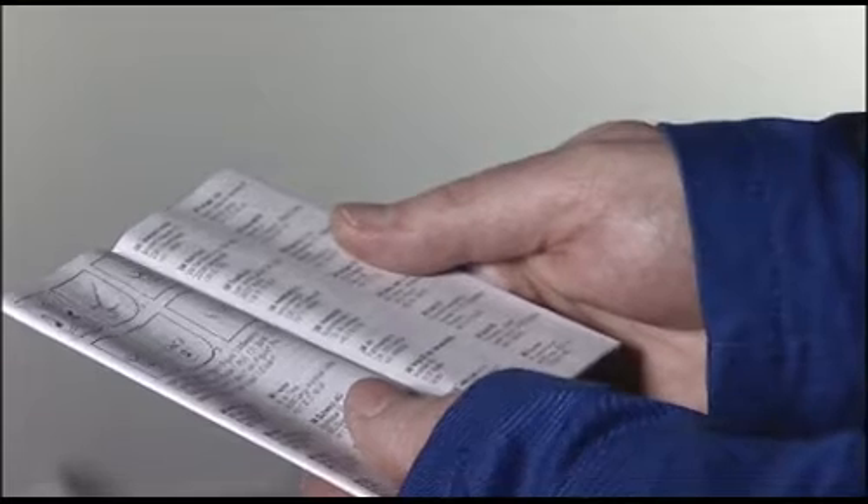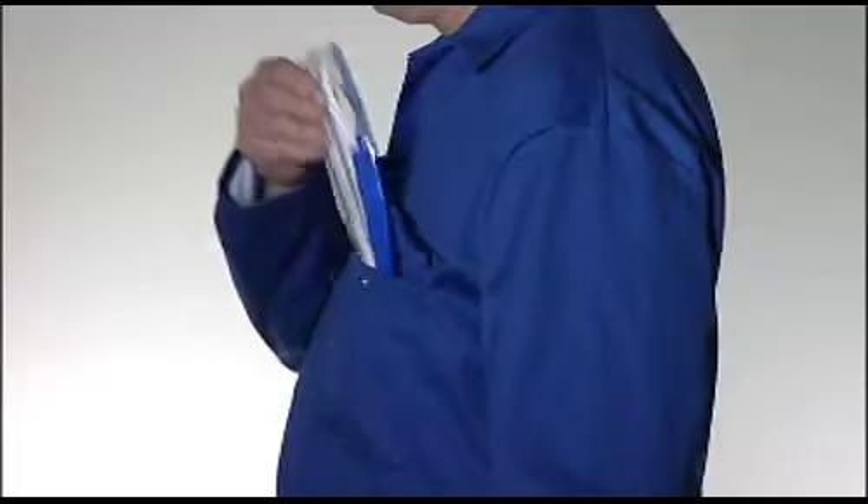Check the expiry date on the box has not passed. Familiarize yourself with the user instructions before attempting to fit the respirator.